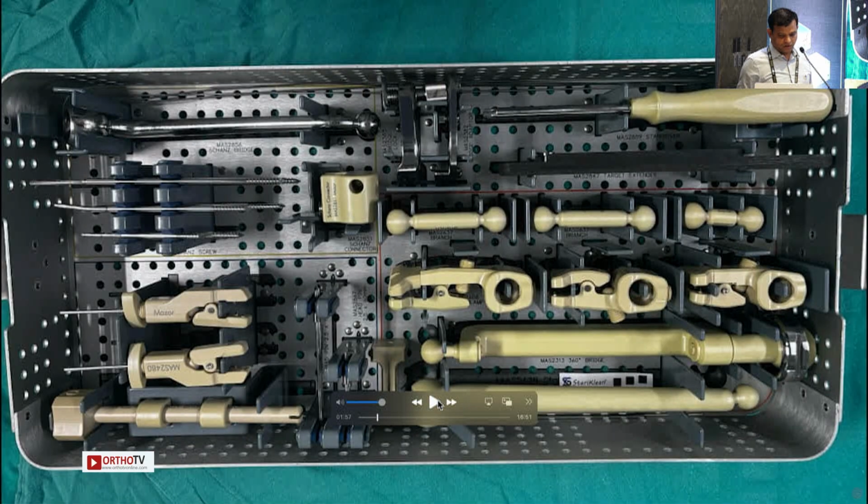So these are the different types of clamps which you can use for marrying the robot. These are spinous process clamps, and there are double clamps also, and this is the clamp bridge which allows you to firmly secure these clamps, because these clamps can be combined and give a firm fixation to the spinous process.